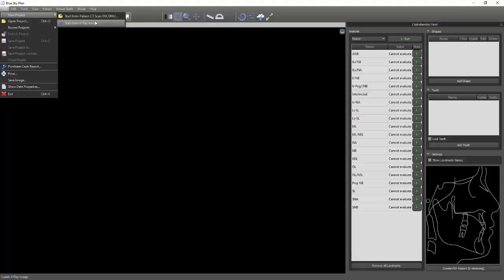Now, just realize that if you're using a small field of view scan, or limited field of view, or medium to small, you might not capture everything. You might get many of the landmarks, but you won't be getting everything behind the ramus.